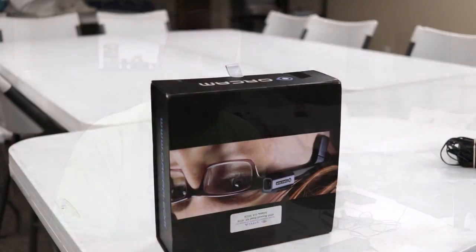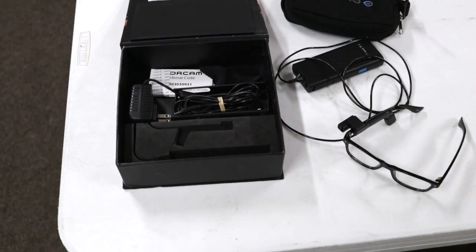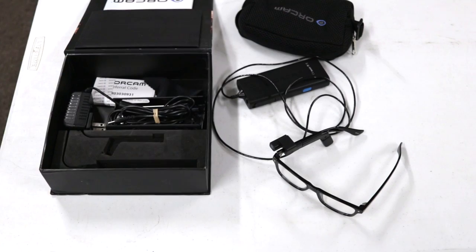Hey guys, it's Sam with The Blind Spot. Today we've got something special. I'm going to be showing off the new OrCam system. A lot of people have been asking me to check this out, so we got one here in the office and we are going to take a look at it today. Spoiler — it's pretty cool.